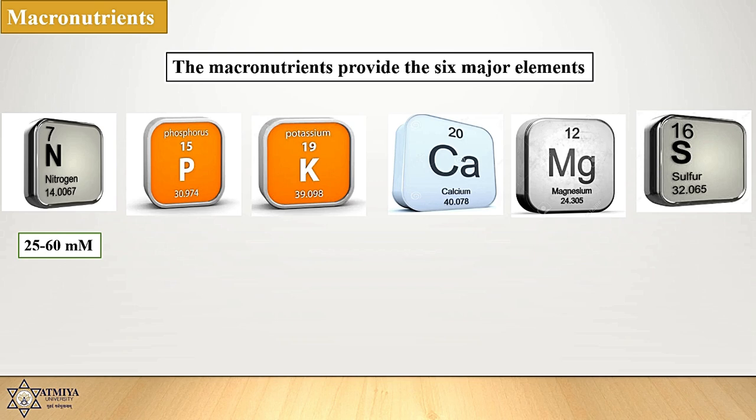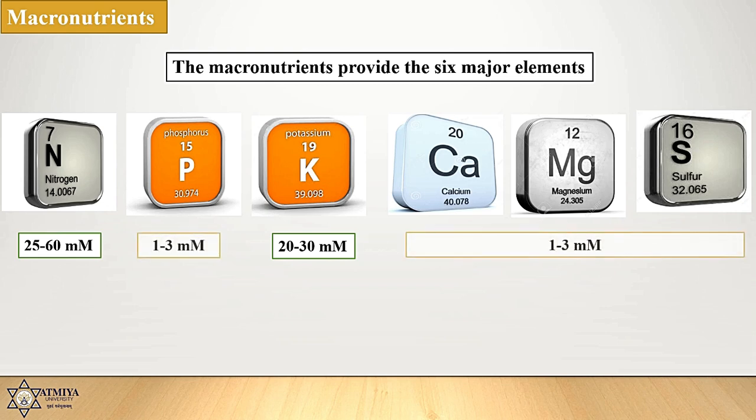Potassium is required for cell growth of most plant species. Most media contain potassium, in the nitrate or chloride form, at concentration of 20 to 30 millimolar. The optimum concentration of phosphorus, magnesium, sulfur, and calcium range from 1 to 3 millimolar when all other requirements for cell growth are satisfied. Higher concentration of these nutrients may be required if deficiencies in other nutrients exist.